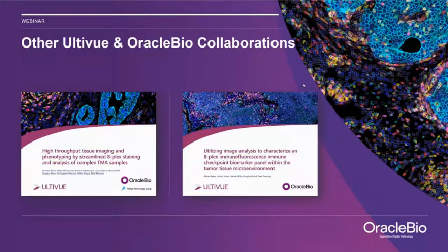Okay, and have you worked with hepatocellular carcinoma or hepatocytes? Is there an autofluorescence problem due to potential reactivity or false positive staining in cytoplasm? Well, I have mentioned that we can basically work with any type of cancer because we have really standardized conditions that apply to any type of tissue. I have to mention, I agree, and I'm aware of the fact that hepatocellular carcinoma can have a much stronger background.